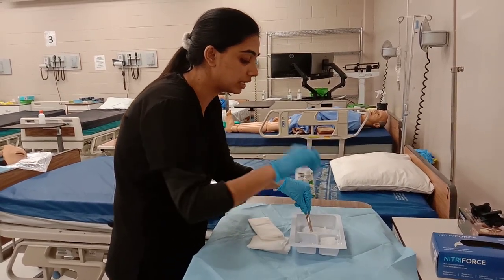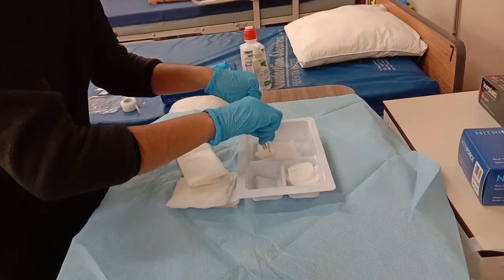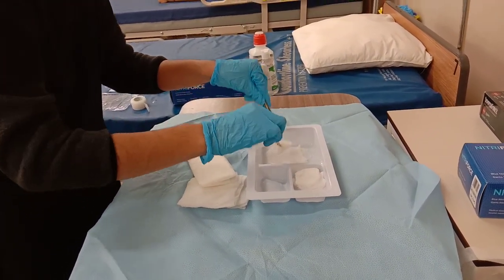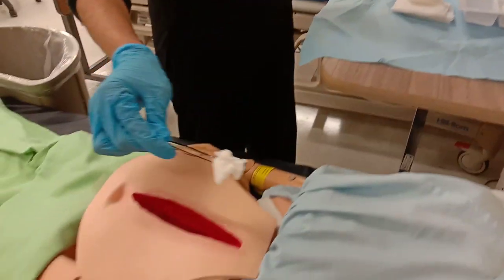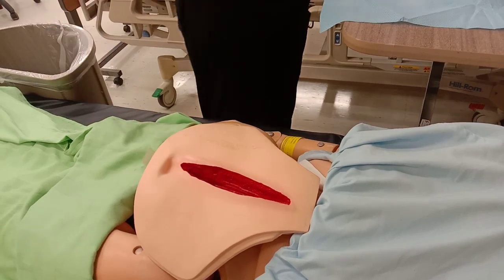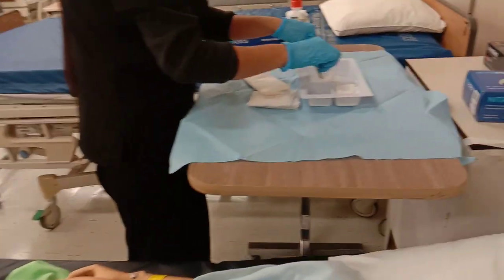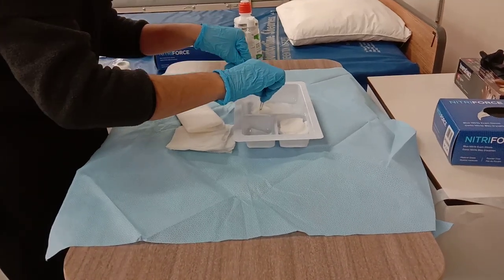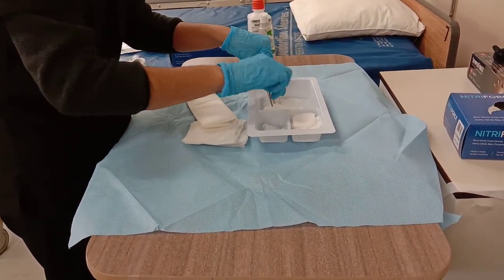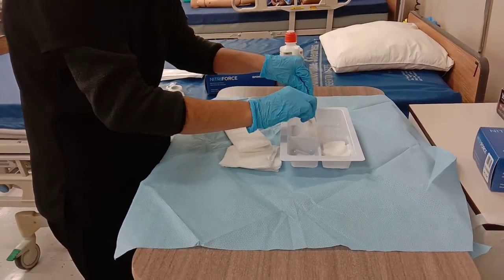I'm picking it up from the top, as the top is clean and the tips are sterile. I'm going to clean my wound first from the midline, top to bottom, one stroke, garbage. I'm going to clean it, squeeze it appropriately.